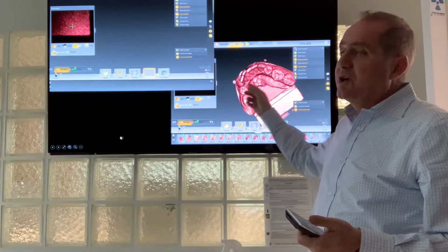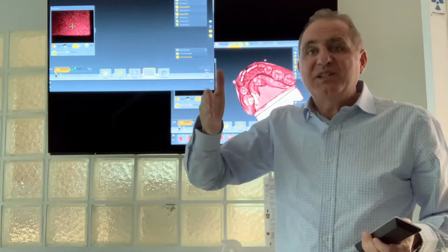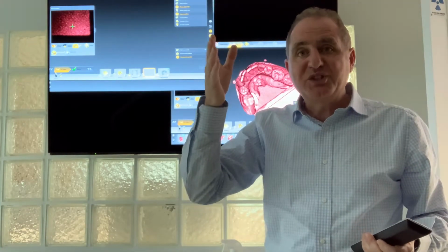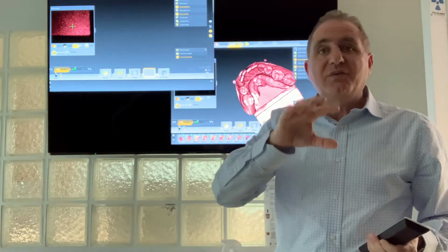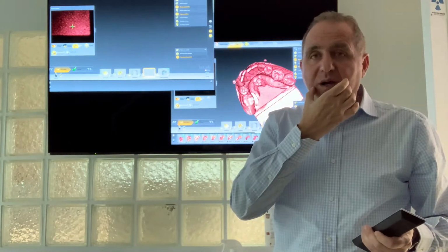we can copy the mandibula, and we can copy many situations of the mandibula. So that every time your patient swallows, you can register this posture and you will add it to the software. So imagine I do 5, 6, 7, as you like, swallowing wax.